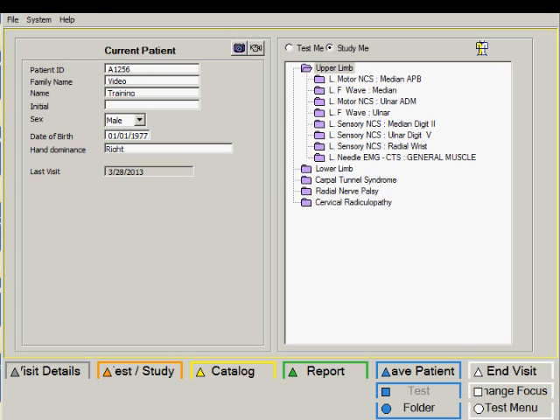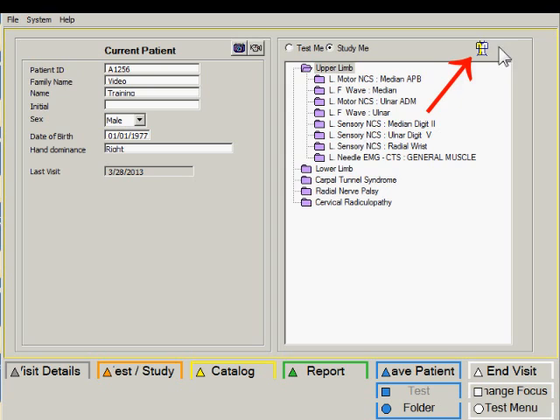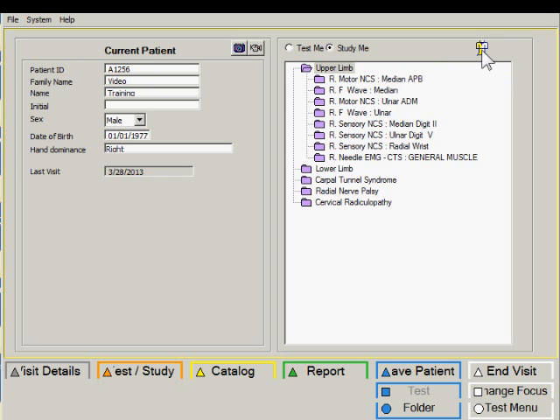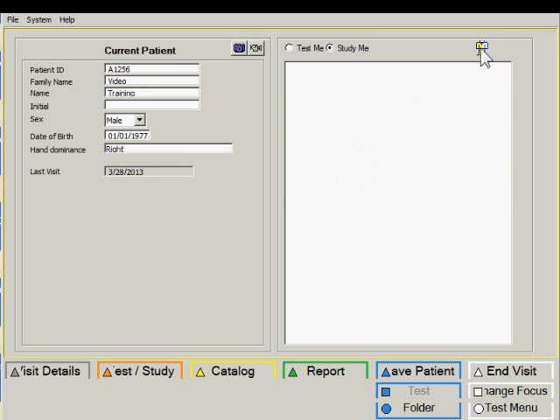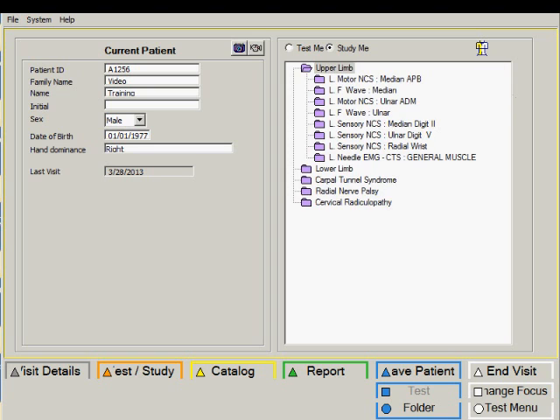I will demonstrate the use of studies using the upper limb protocol. This has been defined to test the left side. If we wanted to test the right side, click on the icon at the top and now all the sides have been changed to the right. And if I click here again, the sides will revert to left. Let's begin testing.